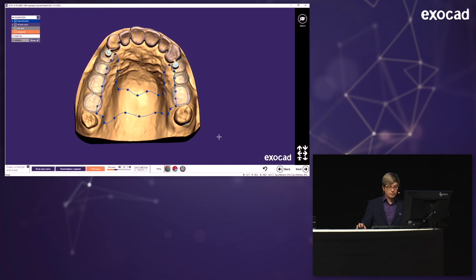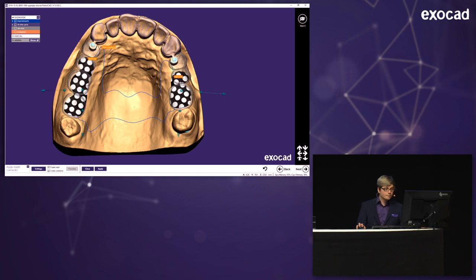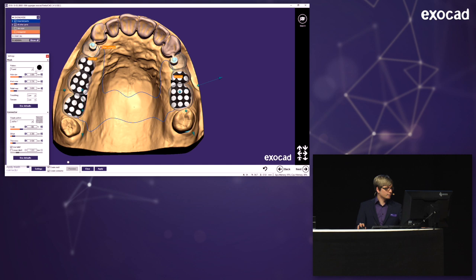OK, so I'm happy with my design. Maybe not completely, but whoever is happy with their own designs. So to the next step. And now I'm placing the retention mesh. You see here are some arrows. I can move this around. And using the arrows further out, I can turn this mesh and actually also change the size. But I can, on a classical way, also press settings down here. And I can just choose several settings for the retention meshes. Maybe I want a square retention mesh, but I personally prefer the round ones.